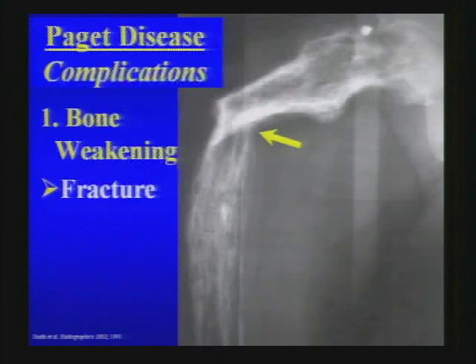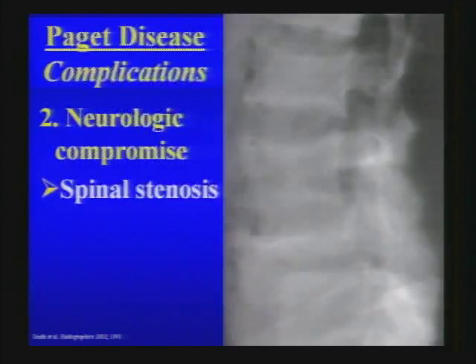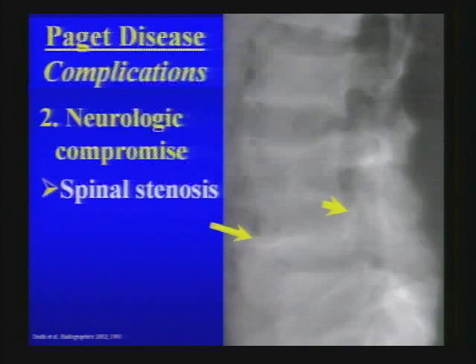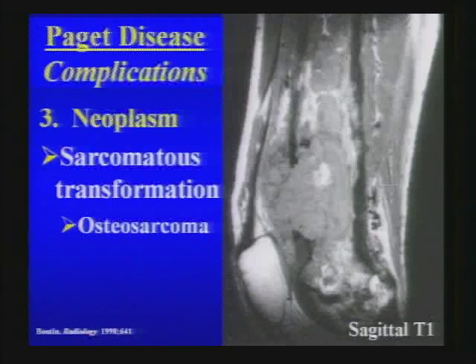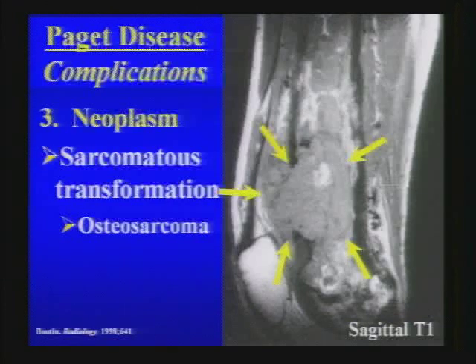Look for fractures with Paget's disease. Neurologic compromise is another important complication — spinal stenosis may occur due to osseous expansion or, in some cases, a pathologic fracture with retropulsion. The most dreaded complication is sarcomatous transformation, in this case into an osteosarcoma, evidenced by marrow replacement, cortical breakthrough, and an adjacent soft tissue mass.